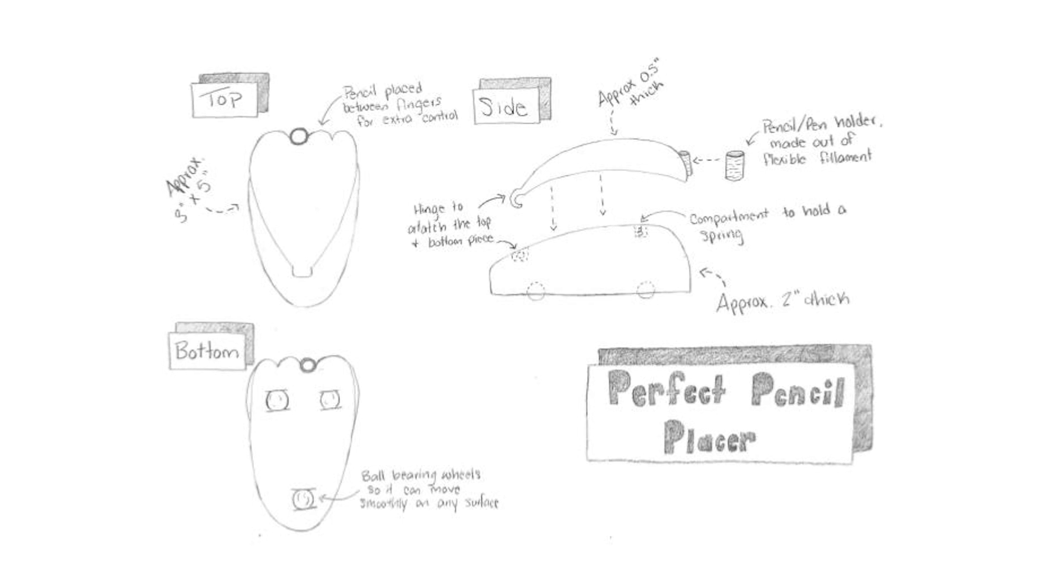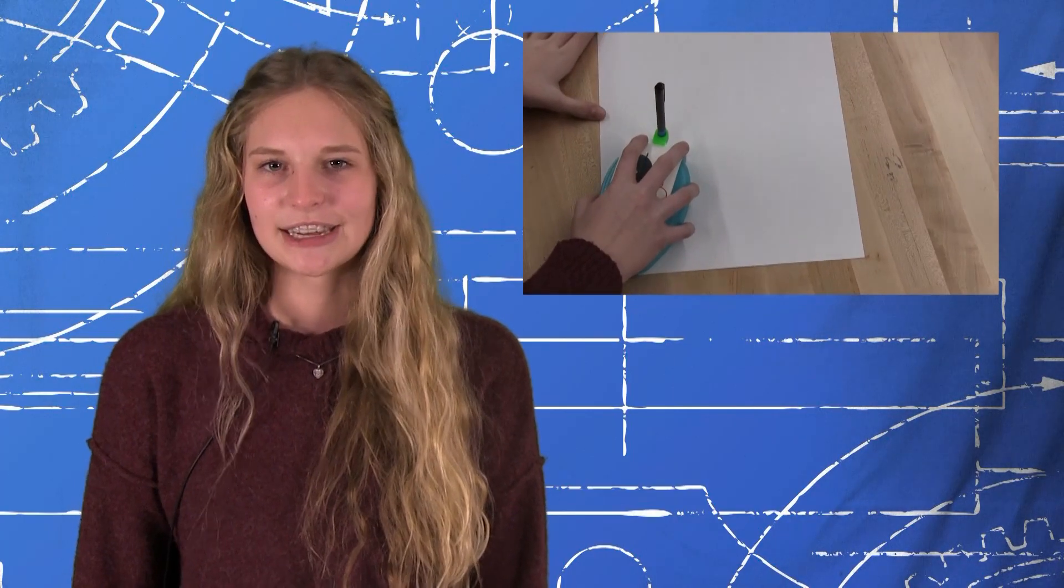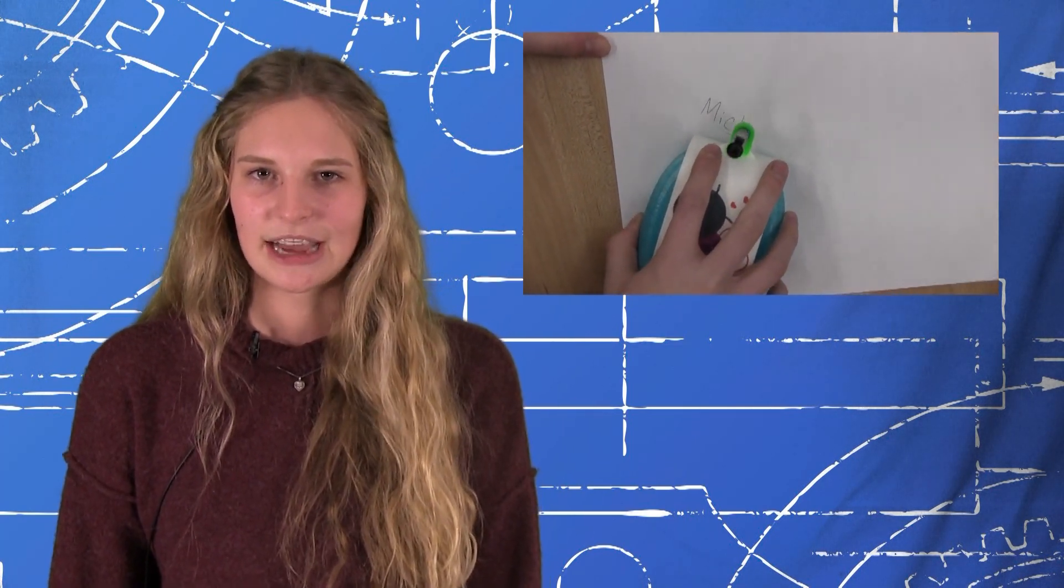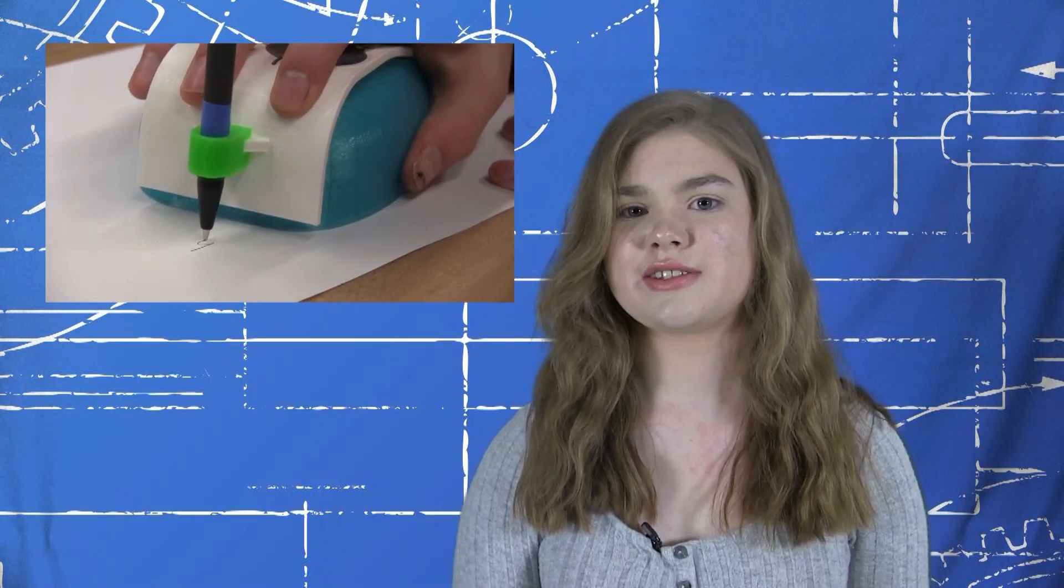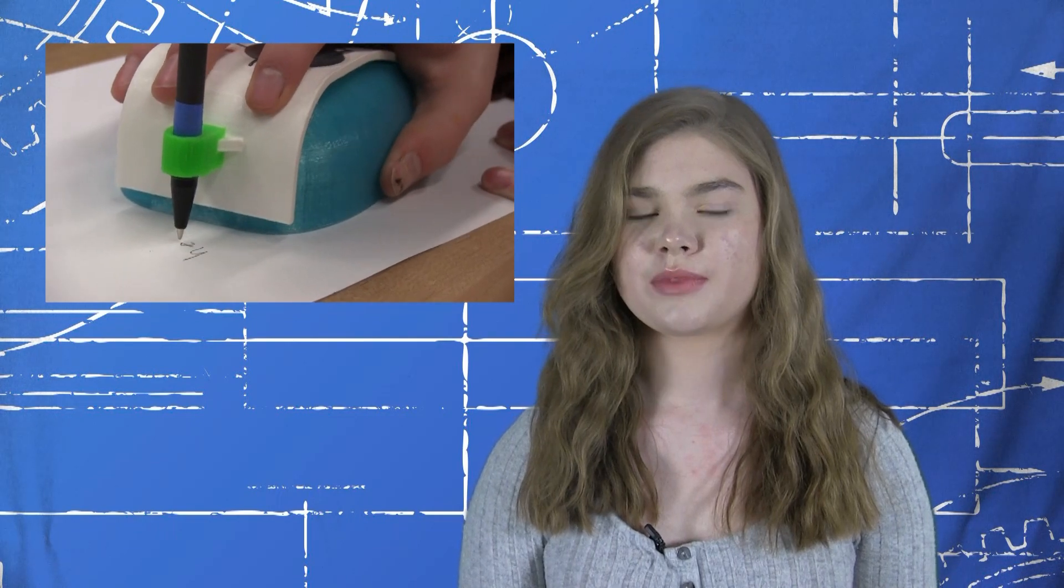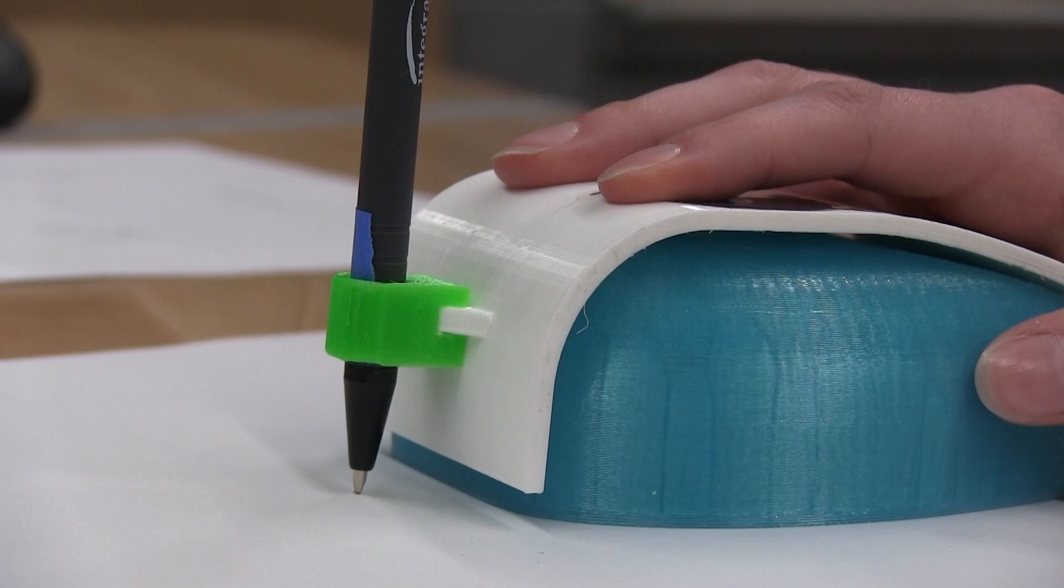The design I refined is an assistive writing aid called the Perfect Pencil Placer. It was developed by engineering students Jasmine and Megan for their end user Michelle who has hypotonia. This is a condition that makes it difficult for her to grip a pen or pencil for a long period of time. As a whole the design performs its function perfectly, and considering it was created over a weekend without any previous knowledge of Fusion 360, it's an incredible achievement.